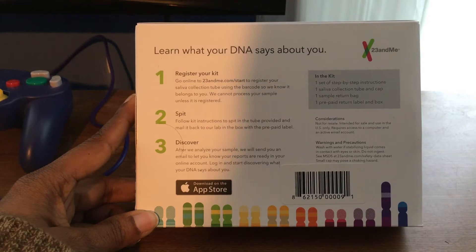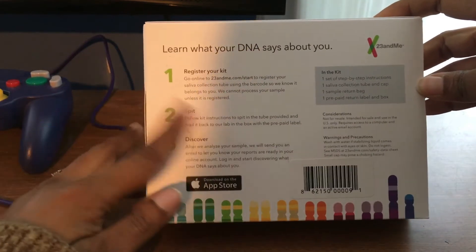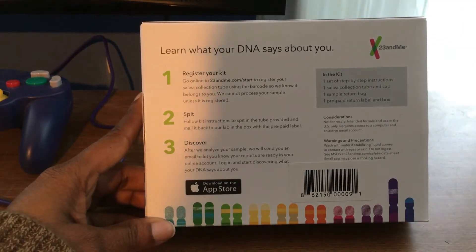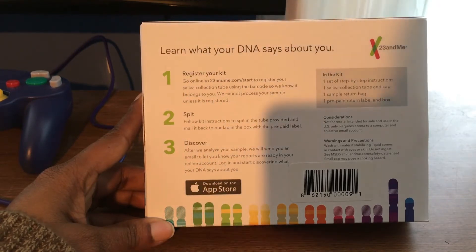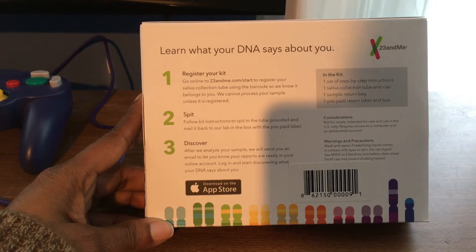The first step says you need to register your kit. You have to go online to 23andMe.com and register your saliva collection tube using the barcode, so they know it belongs to you. They cannot process your sample unless it is registered.